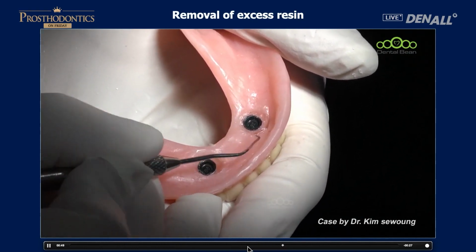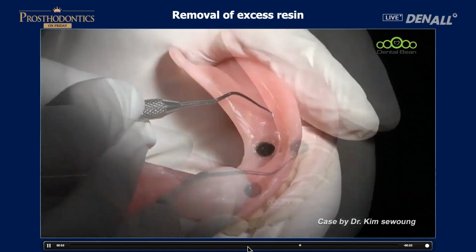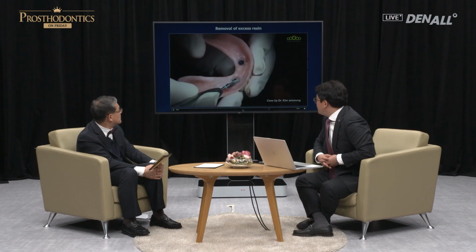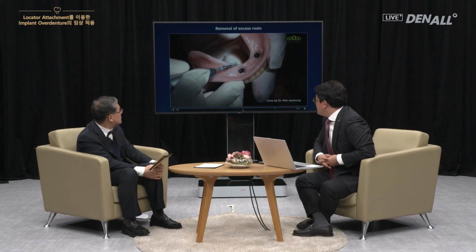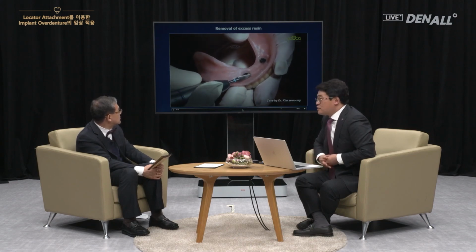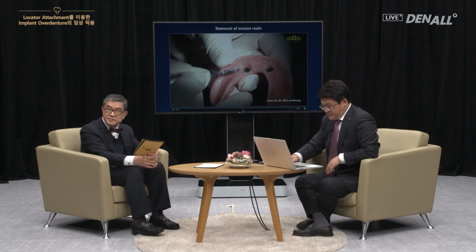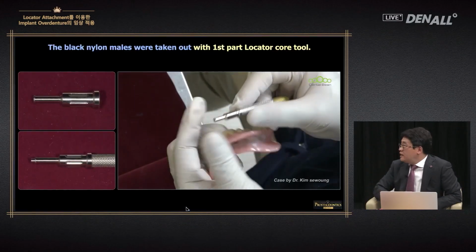If we use denture burr for removing excessive resin, at times the denture-based resin can be affected as well, so using Vaseline is a very good way. If we are not careful, denture burr can remove denture-based resin as well. What is most important is that you should not apply Vaseline inside of the hole, just outside of the hole. Now you can see that it is now clean.